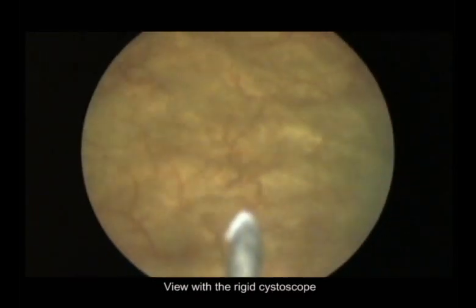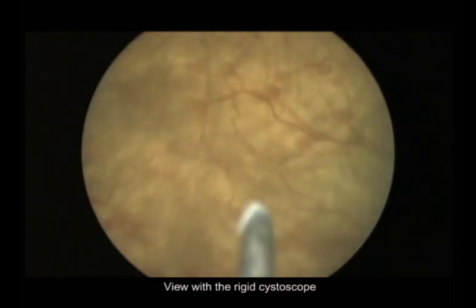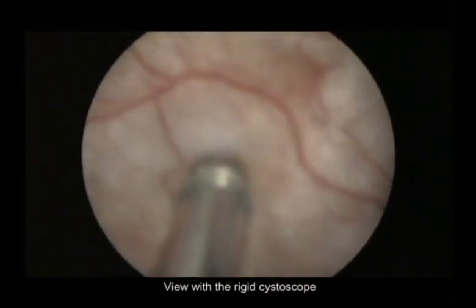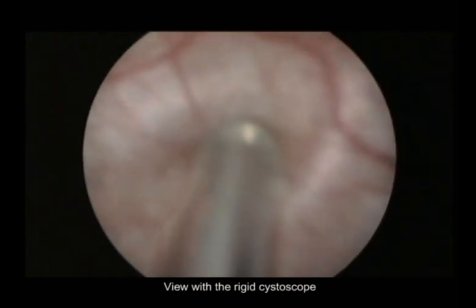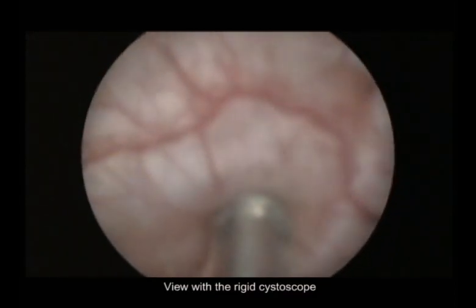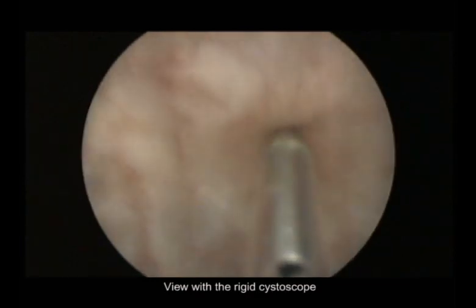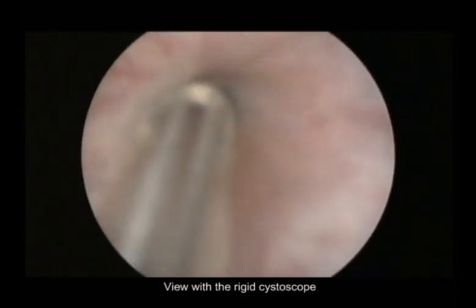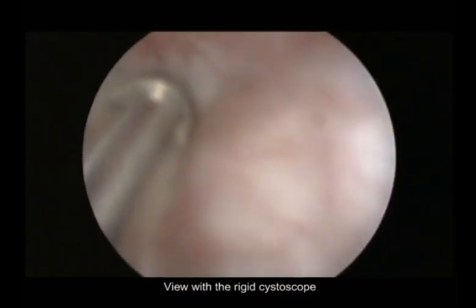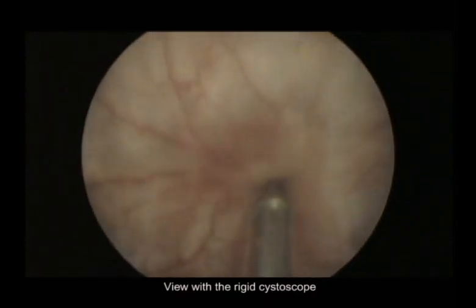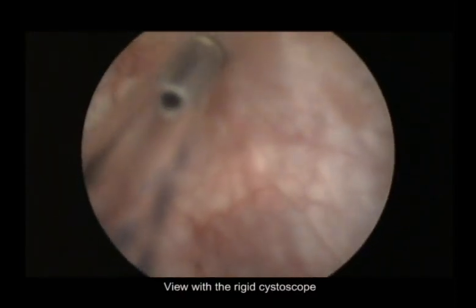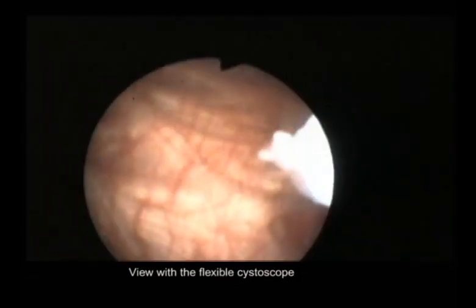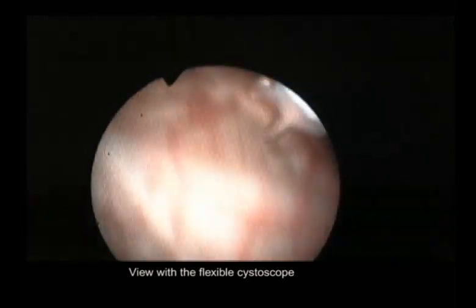We select an injection site without blood vessels and we push the needle into the bladder wall. As the tip of the Bonee needle is only 4 mm we can push it in to the needle neck. We inject 1 ml of the solution. In some cases we may be able to see a bulb here at the injection site.